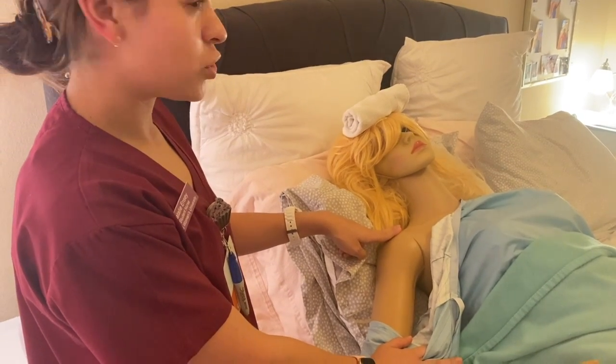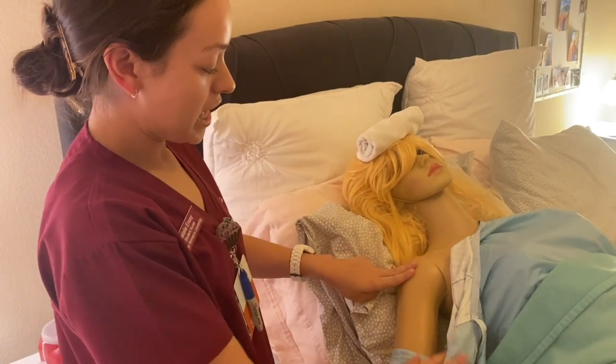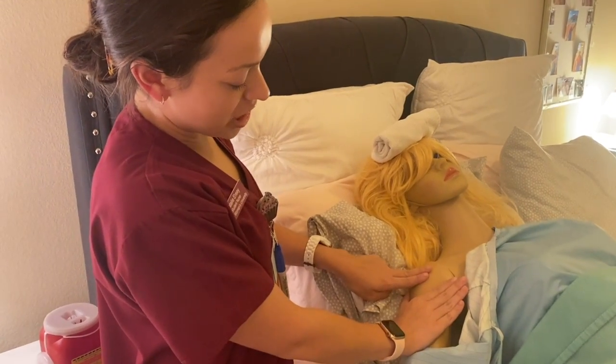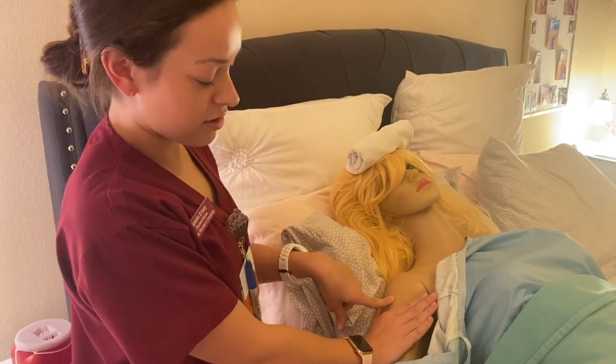And then I would go 2 to 3 finger breaths down, so 1, 2, and I'm gonna have like a V triangle shape right here, and I would inject the injection in the middle of that at a 90-degree angle.